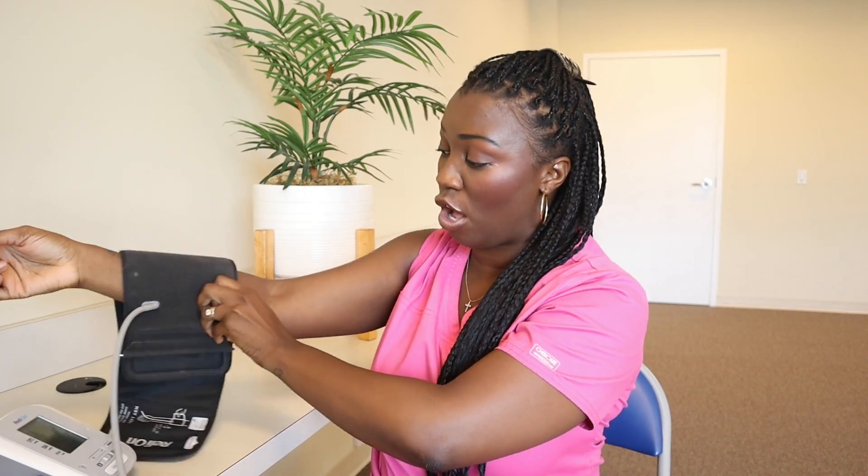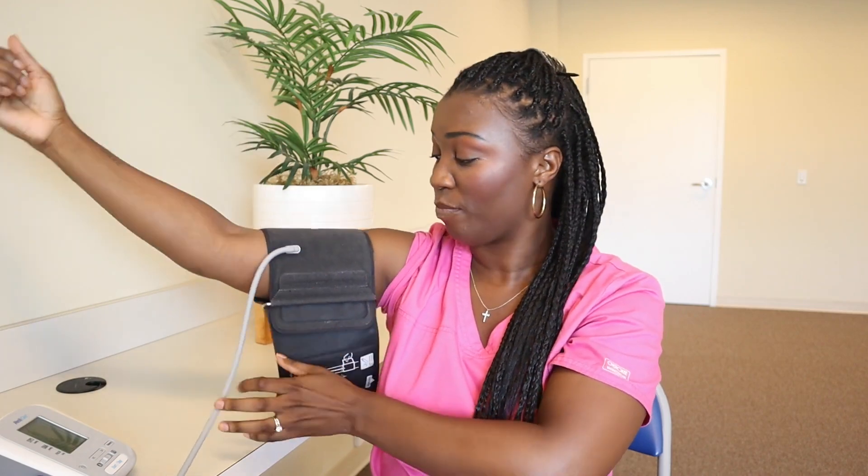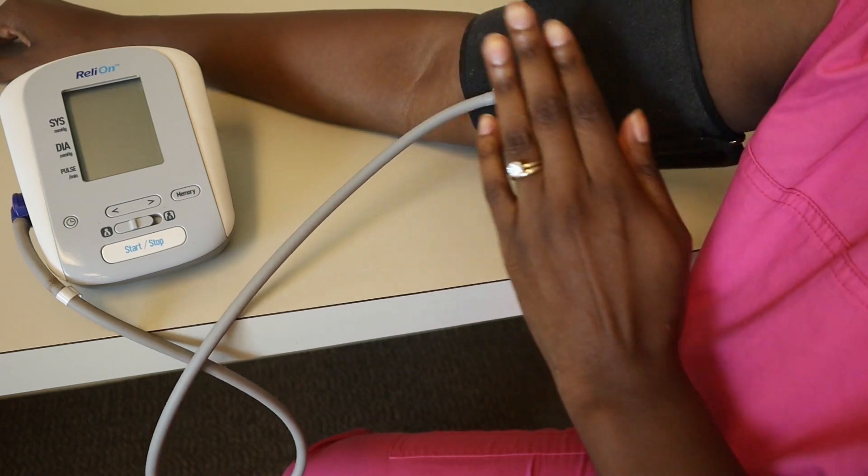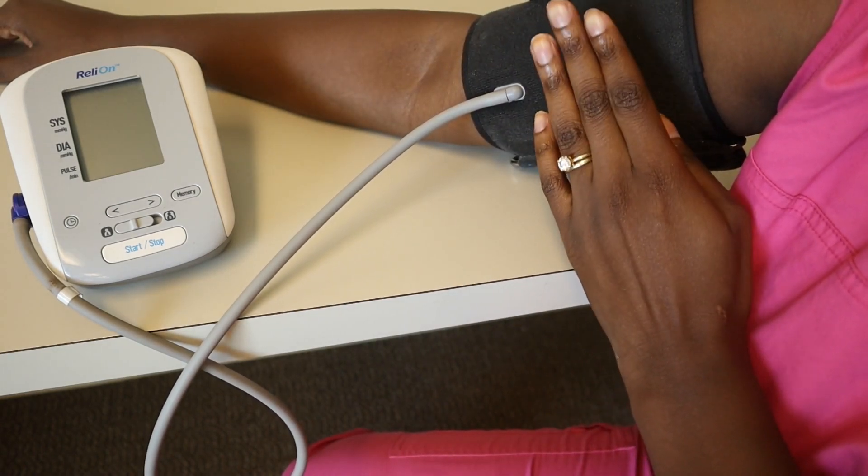So I'm going to go ahead and place the blood pressure cuff on me. I'm rolling up my sleeve so I'm placing it directly on my skin, and now I'm going to slip it on. I'm putting the base of the blood pressure cuff about half an inch above my brachial artery — about half an inch above my elbow — and I'm going to secure it using the velcro. When you're securing it, you want to make sure the cuff fits snugly and is not moving around on the arm, but you don't want it to be too tight.